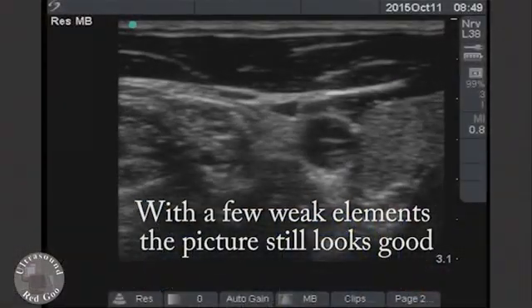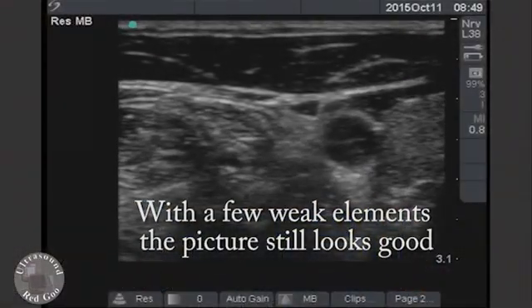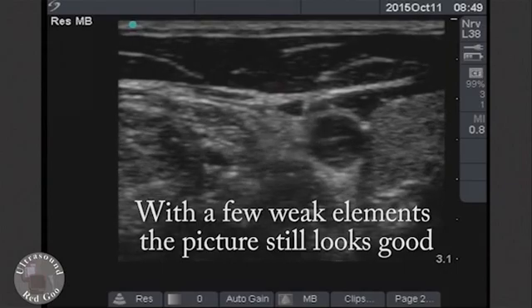Now as you saw we had some weak elements there, but on this particular machine that doesn't make much of an imaging quality issue for me for the type of exams I perform.